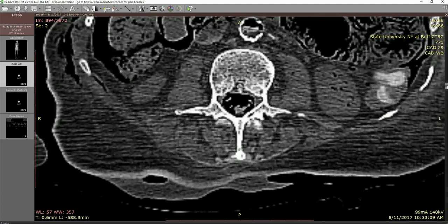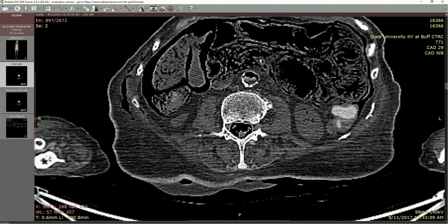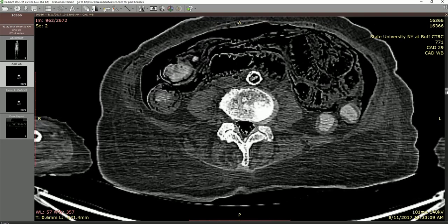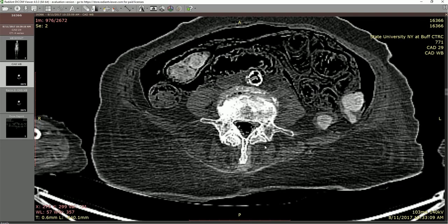Continuing a bit further down and expanding the view, the next things of significance are the transversospinalis group, the erector spinae group a little further out, the thoracolumbar fascia leading into latissimus dorsi, and then a lot of subcutaneous fat tissue on the outside — this is an individual with more subcutaneous tissue. The next big thing of significance: these are the wings or ala of the ilium. We're right at the level of the pelvis, and we're going to start to see these come and fuse in, transitioning into the sacrum.